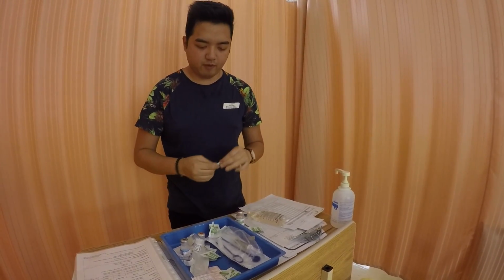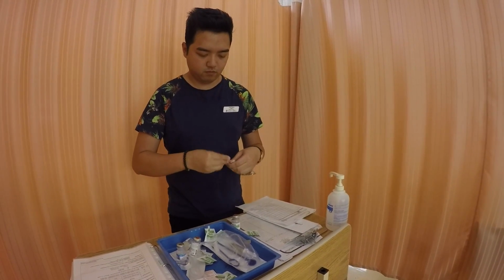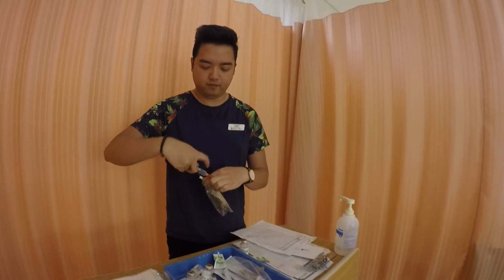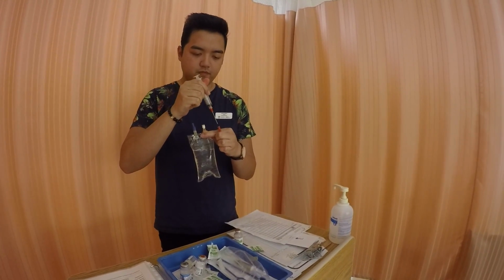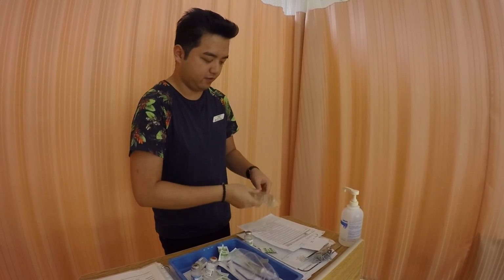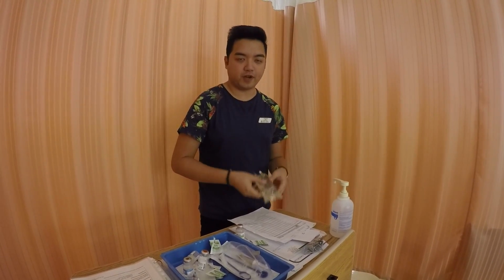So we need to swab again the medication port for 30 seconds, let it dry for 15. Then we can inject. Okay, so now we have a total of 15.8 ml medication inside this bag. Okay, just gently mix it so that it's well incorporated.